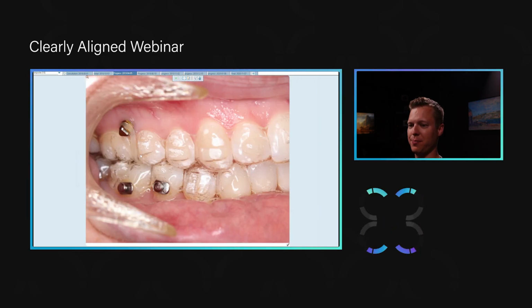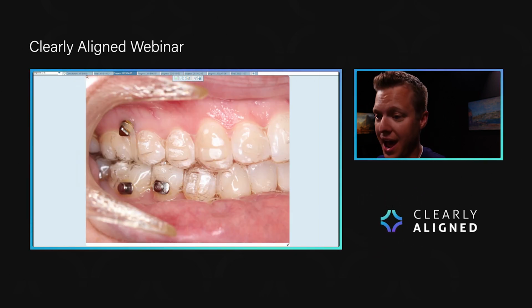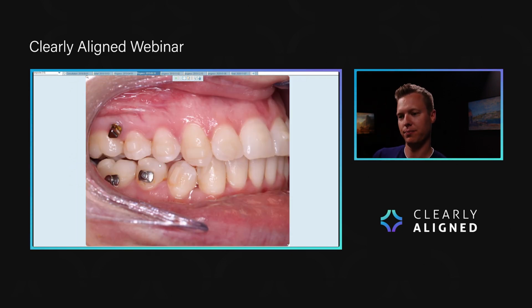Essentially, all that's happening then is the elastic just slowly over time is pushing up on those teeth and intruding them little by little by little.